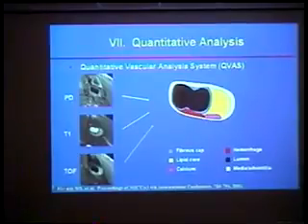The last thing I'd like to talk about briefly is that within the lab, I would say half of the people are concentrating on trying to quantify the information that we get from those multi-contrast images. Ultimately, we want to get images like this from different contrast weightings. We hope that we can integrate all this information into a map like this.